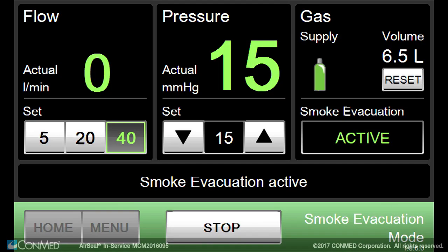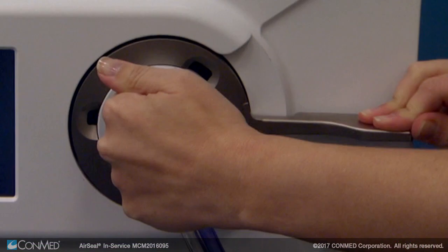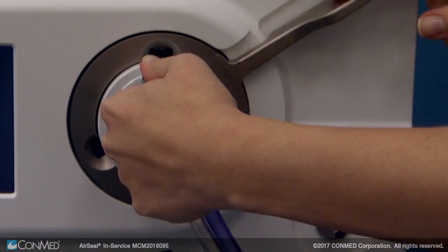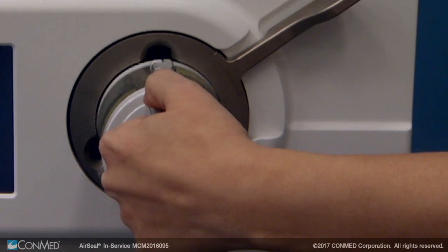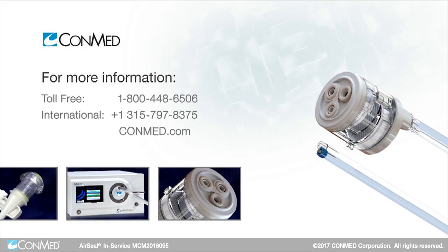At the end of the procedure, press stop prior to disconnecting the filter tube set from the IFS unit and powering off the IFS unit. Please proceed to the next module for more information.